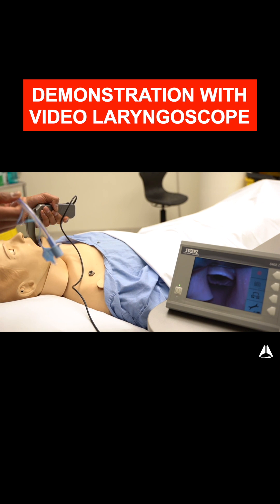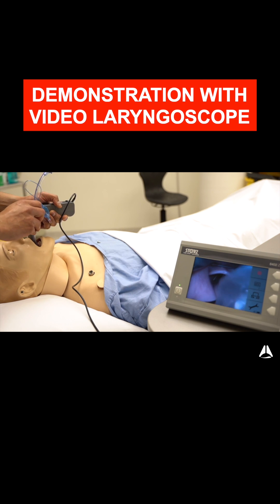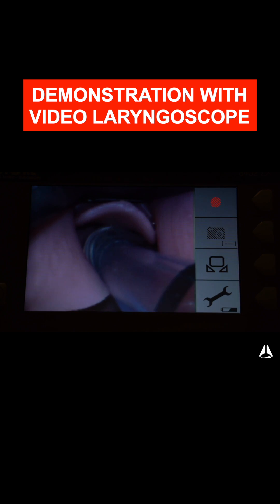Now just to demonstrate inserting this tube — if I insert it this way it blocks my view completely, but if I insert to the side it can really help my view.